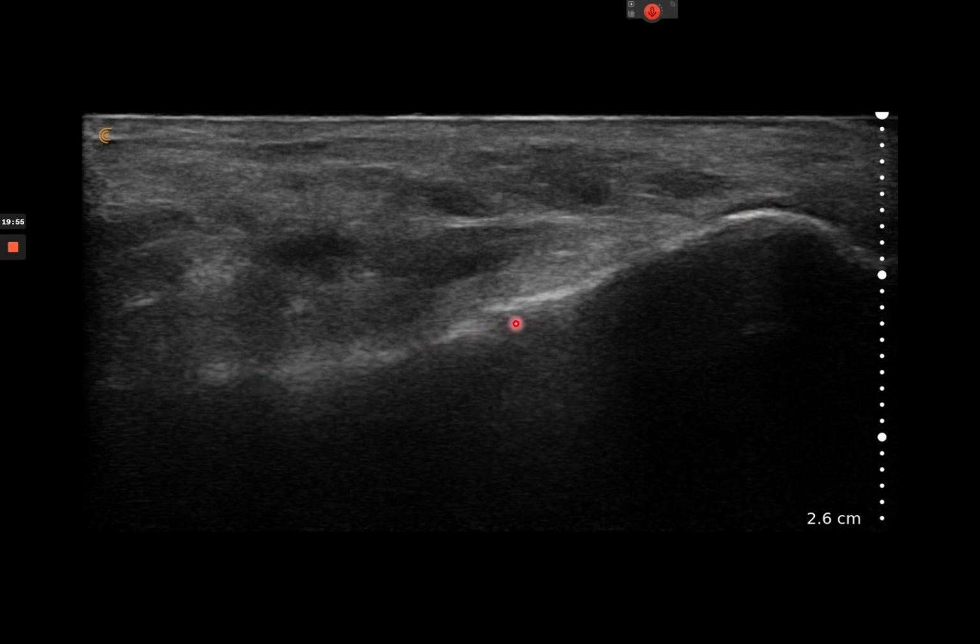It's not a very good image, and based on this image alone, I wouldn't be calling anything. But based on that whole clinical context, I can see cortical lifting here. What happens with ultrasound is it can't penetrate through bone. See how the acoustic shadowing here is very dark? See how the acoustic shadowing opens up? That's a loss of bone mineral density there because some of the echo is getting through the bone. And we've got this little defect here.